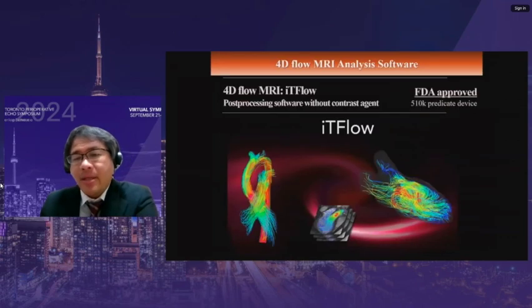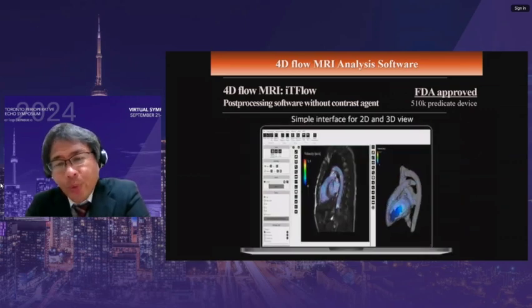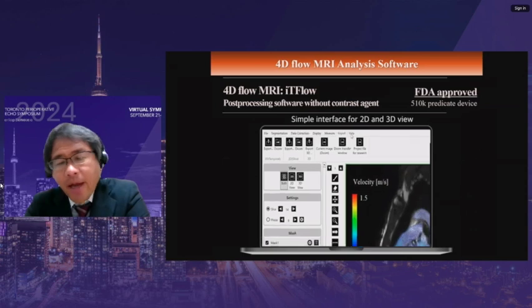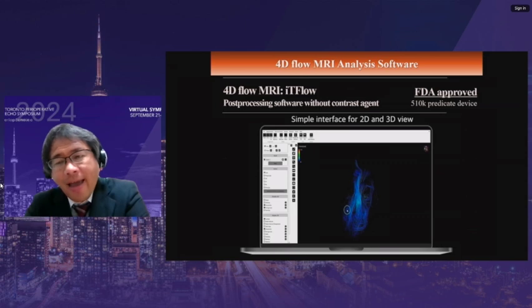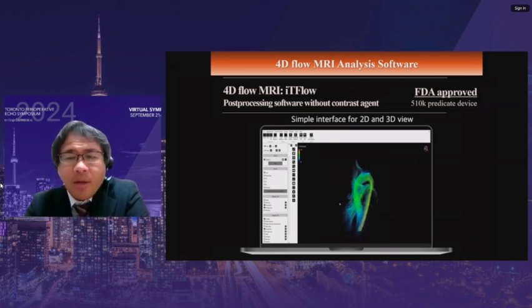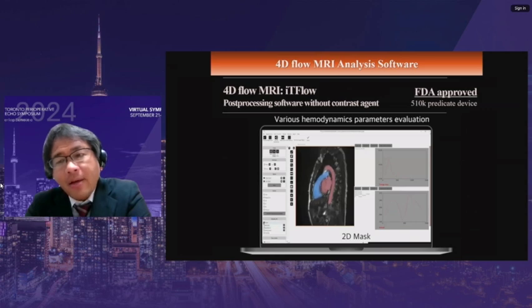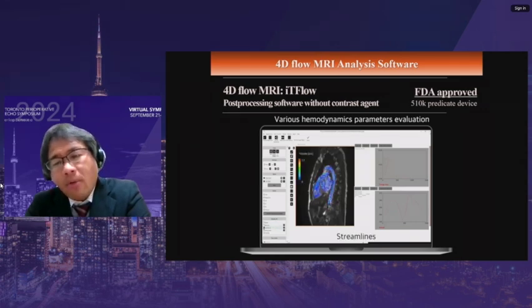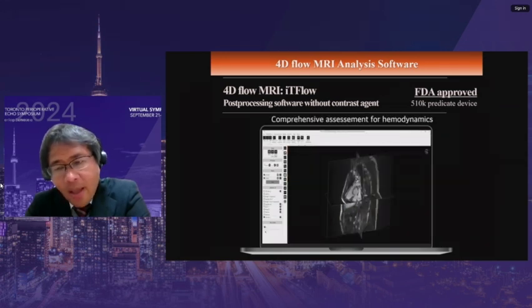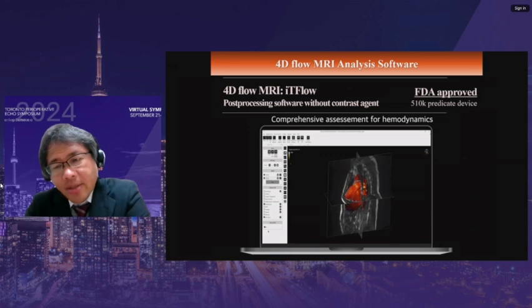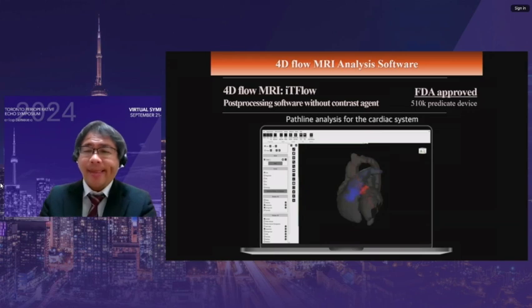For the assessment of hemodynamics, 4D flow MRI is a powerful tool. This is software named ID-flow, which acquired FDA approval, that I have developed. It uses a user-friendly interface to segment LV and RV, where blood flow is visualized both in 2D and 3D. Additional functions such as flow energy loss estimation or pathline analysis are easy to handle.